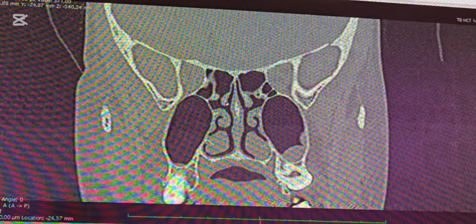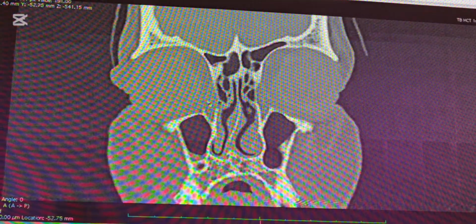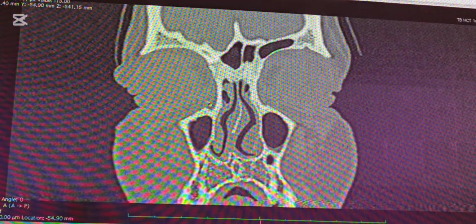So what is this structure? Superior turbinate. So we have seen inferior turbinate, middle turbinate, superior turbinate, uncinate, accessory ostium, how the maxillary sinus opening, frontal sinus opening, everything. So now again coming anterior to posterior. So here I would like to see something. What is that?